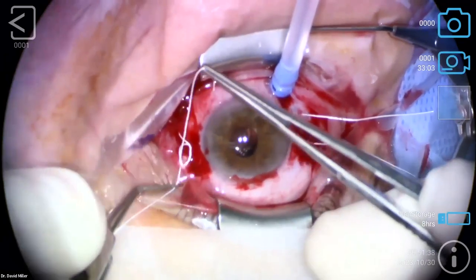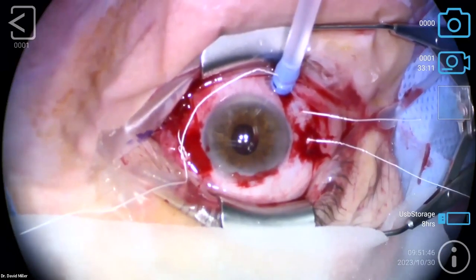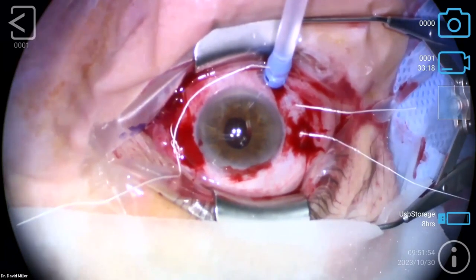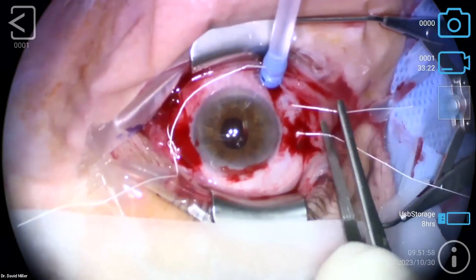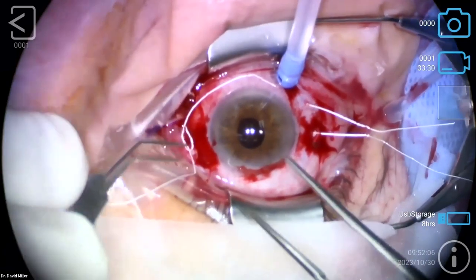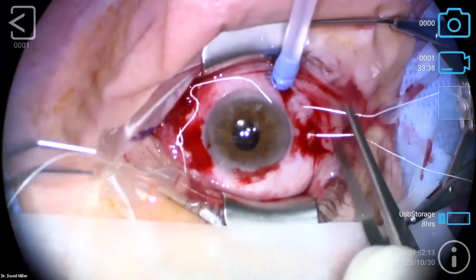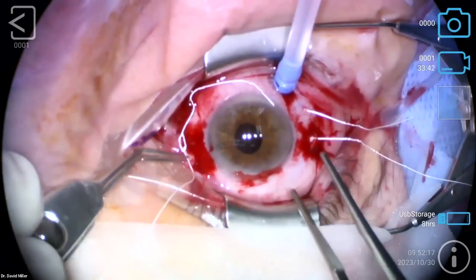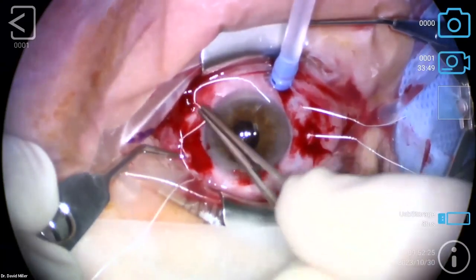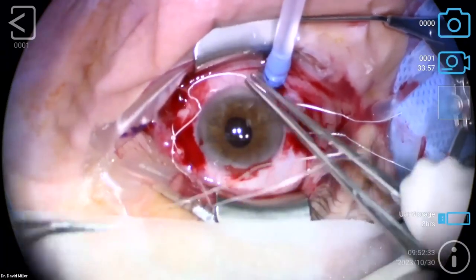I'm not going to put it down quite yet because you saw the lens implant jump. So we're going to make sure we're in a good spot again, because it's on my finger here. There we go. Just cut this off right here. This piece is giving us a little trouble. There we go. Just cut another side, because it was getting wrapped around other stuff, including my finger. Just making sure we're well centered. And if we're not, like I said, you can always untie these knots. The Gore-Tex is so forgiving, and I've done that a few times where things weren't quite centered like I thought they would be.